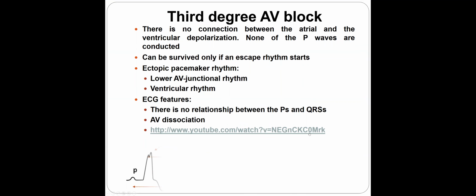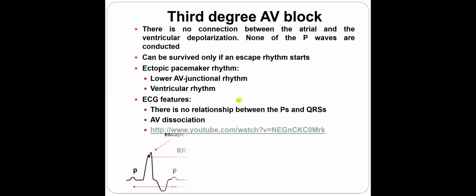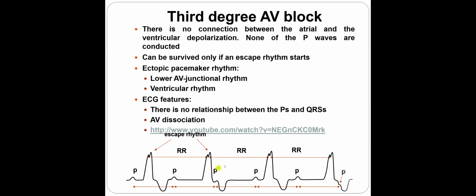Now, as you see here, I drew you a ventricle escape rhythm. And as you do see, we do see the P, P, P, P interval. Again, get a paper, underline the paper and mark the P-P interval. When you shift it, you will see that some P is located inside the QRS complex, or on top of the T wave. And you can see a little notch or little altered QRS complex. But this PP is the same.